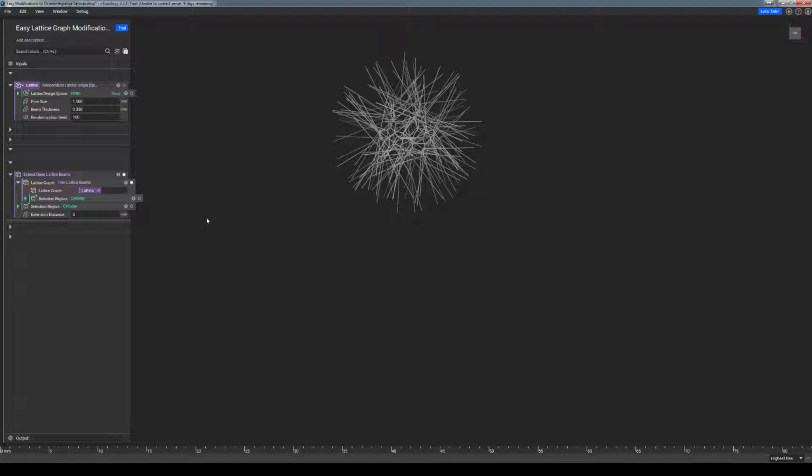If the user is looking to control the extension distance with a field or a non-uniform value, we can see that this input actually accepts fields as well, so something like a ramp block will also work just fine. However, keep in mind that the beams selected for extension are those that fall within the implicit body used as the selection region. Typically, if you are trimming and then extending, just like what we did here with this cylinder, using the same cylinder will be sufficient as a selection region when trying to grab those outer beams.